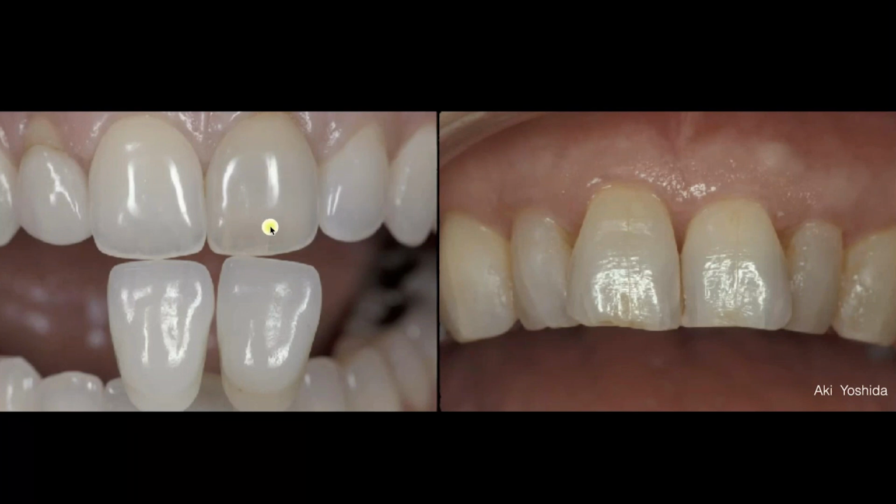The reason is because look at the surface of the tooth. There is almost nothing on it. There's really no surface topography. It's almost a smooth piece of glass. And to make it worse, it's a very low luster piece of glass, right? It's really low in value, and you see a lot of light transmission into the tooth, but you also see no surface. So if I had to make this tooth, I'm going to tell you it's a nightmare.